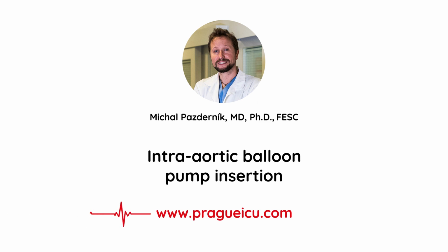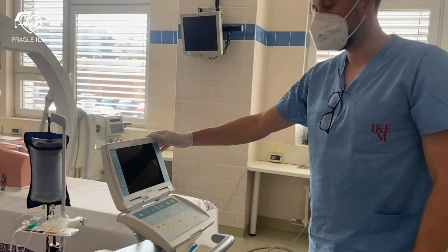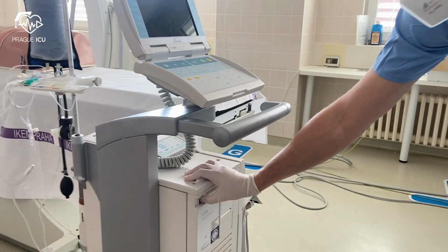Hi guys, I'm Mikhail from Prague ICU, and in this video I will demonstrate how to insert an intra-aortic balloon counterpulsation. In our simulation, we will use the Mackay Datascope CS300 machine with the 50cc balloon catheter. Start the console, then the machine begins to load.